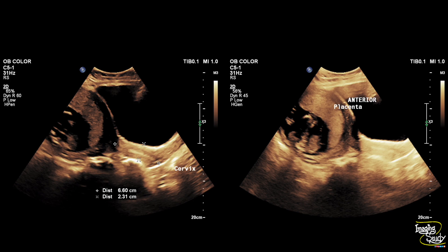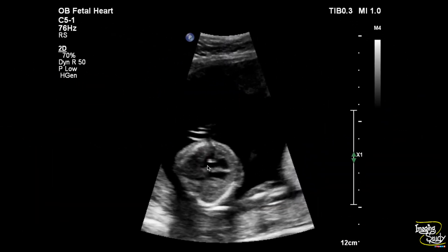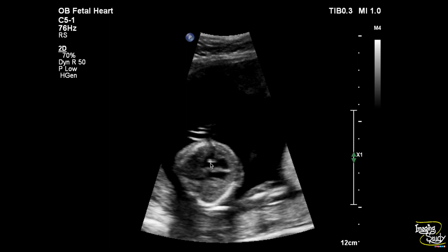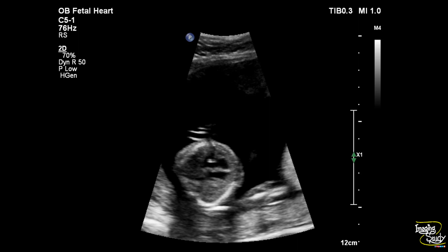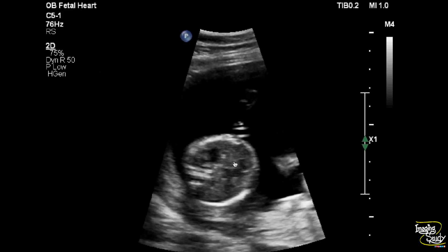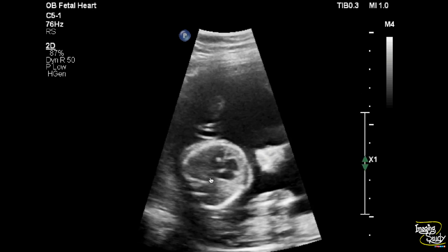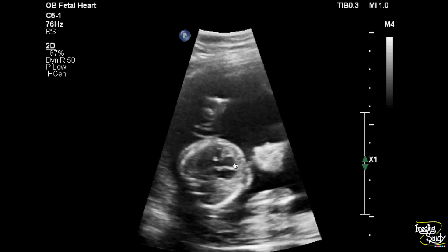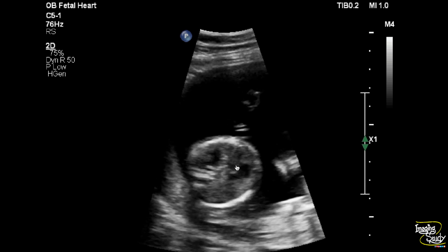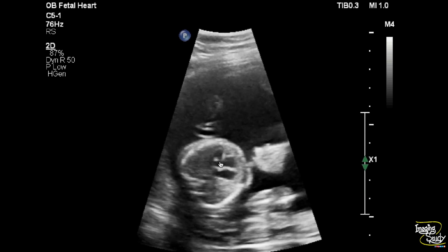Now let's jump into our main topic. During the scanning of the fetal heart we have seen an ecogenic focus, the diameter of which is less than 3 mm, at the left ventricle. Here is the section of the thorax. You can see a bright ecogenic dot at the left ventricle. This is the spine, this is the left atrium, this is the right atrium, this is the right ventricle containing the moderator bands, and this is the left ventricle. So this is the ecogenic intracardiac focus.